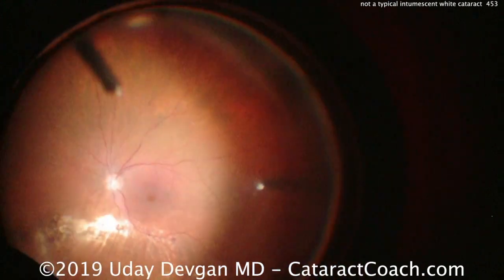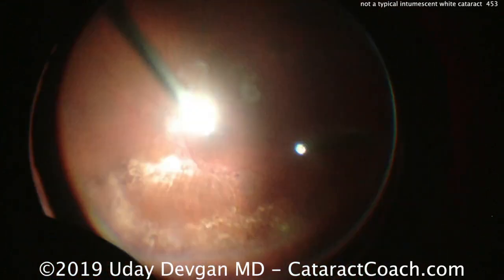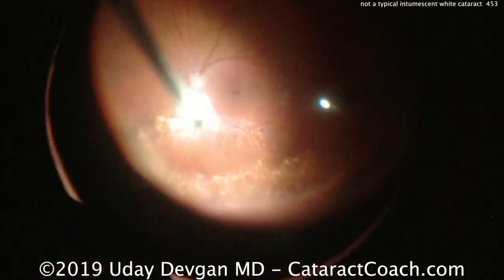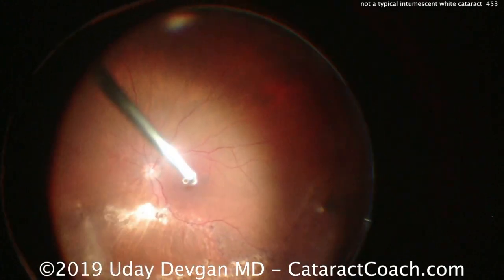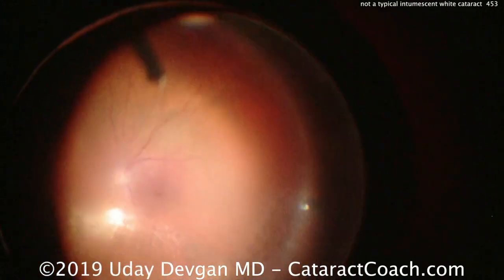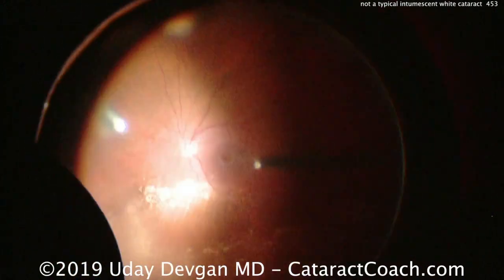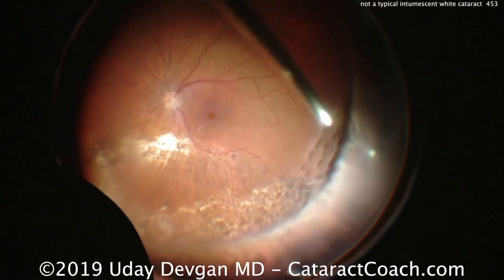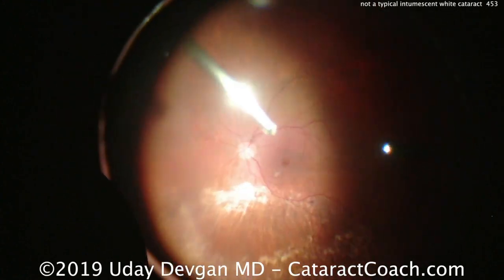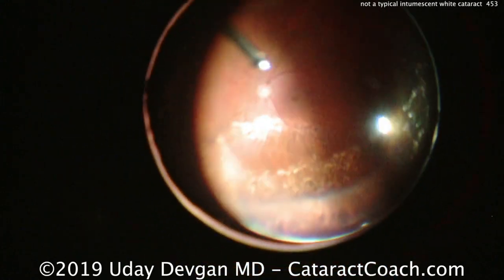So important case here, I think the very important take home message is to pay attention to these small clues. You can tell before surgery by the history, vitrectomy, and then 1 month later, a white cataract. You can tell from the A scan, which showed the defect of the posterior capsule and the lens material going in the vitreous cavity. You can tell even by the slit lamp examination, because the anterior lens capsule, instead of being domed forwards, it was sunken in.